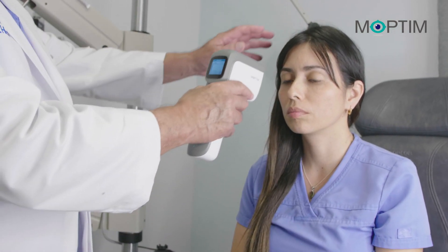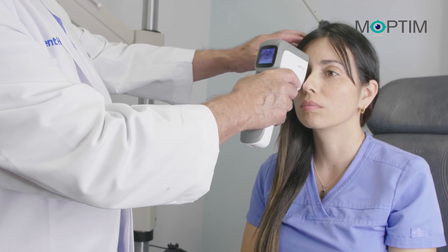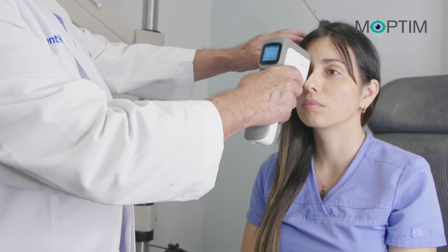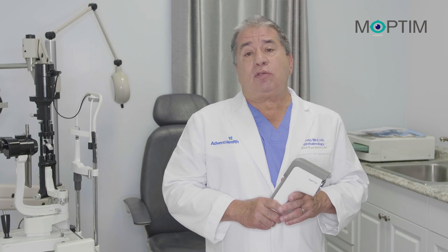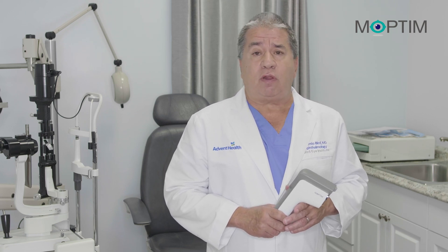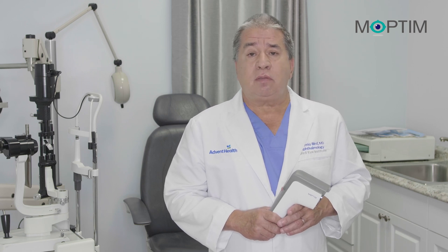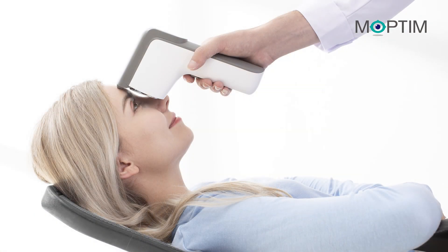The EZ-Ref can measure your patient's refractive error with results equivalent to a subjective refraction. It is incredibly helpful in screening patients and measuring for eyeglasses on patients who are unable to sit in front of a phoropter — for example, wheelchair patients, patients in nursing homes, pediatric patients, and patients who are lying down and cannot sit up, for example like in hospital calls.